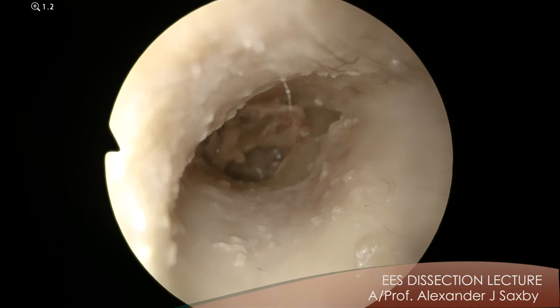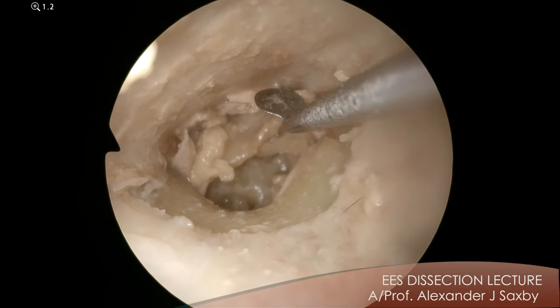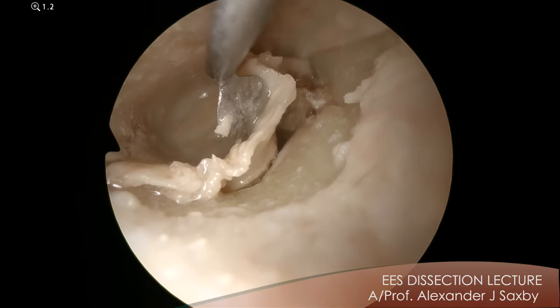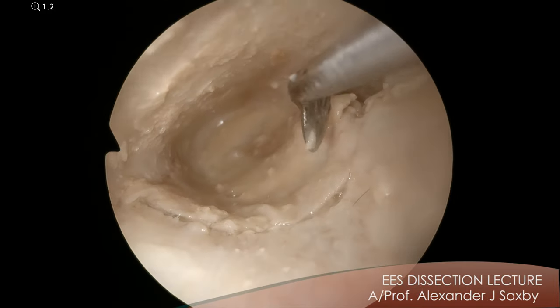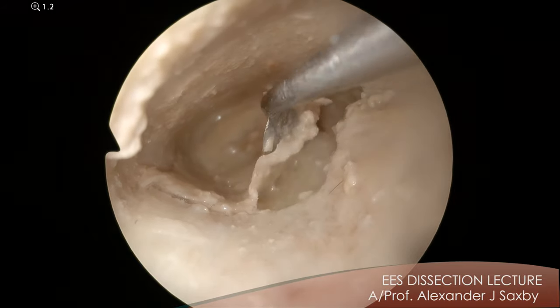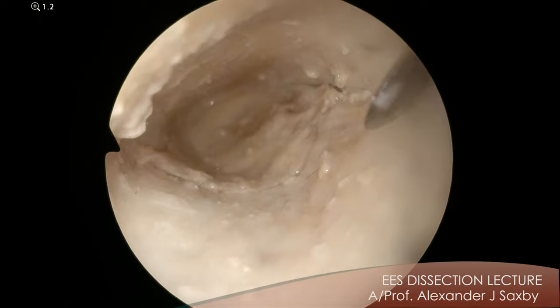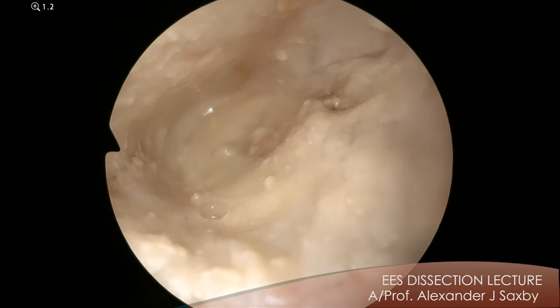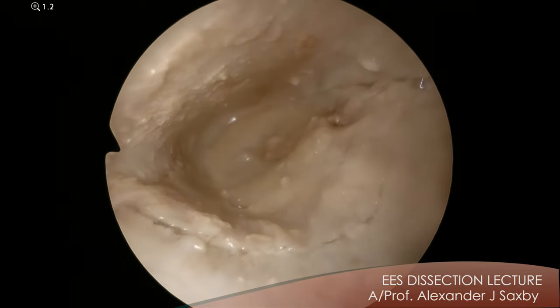My advice then would be when you're practicing on your temporal bone to bring the eardrum back. Pretend you've finished your operation, and just have a practice replacing your eardrum before you remove it. You see the benefit of endoscopic ear — because you've made those single cuts, everything goes back beautifully. You want to see the drum, practice replacing the TM flap. And if you've got it right, it should fit absolutely perfectly, and you know that's going to heal well. Those edges are all opposed — that's going to heal well. You've just taken the drum off the malleus completely, but there is no perforation. So you know there's no implantation of squamous disease because it's still intact.